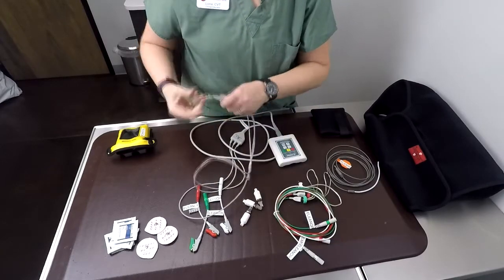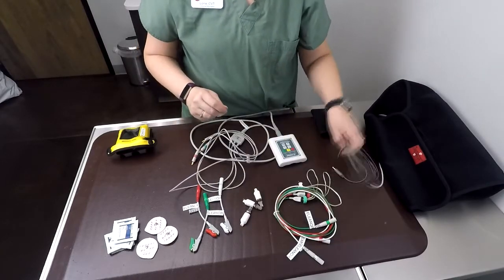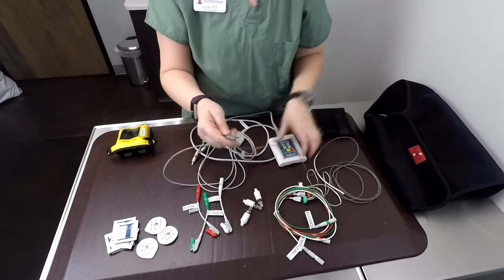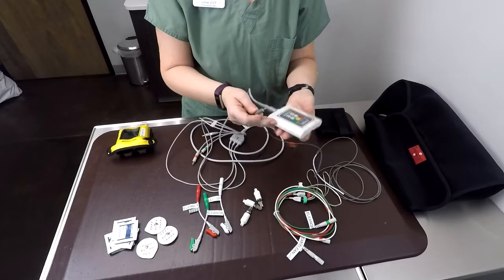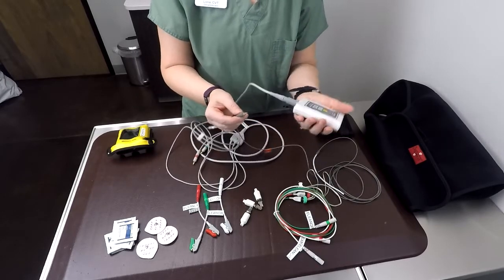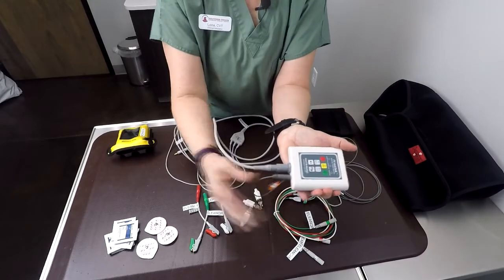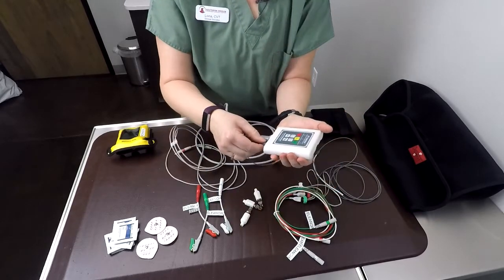An extra feature this unit has that our others did not is a temperature probe. This is a rectal probe, so it's quite useful for patients that are post-op and may not have come back up to temperature, or for a critical patient that's not maintaining their temperature. This plugs right into the unit.